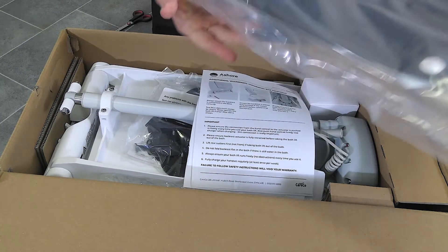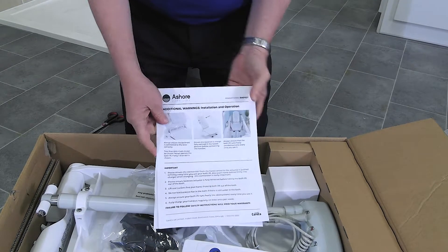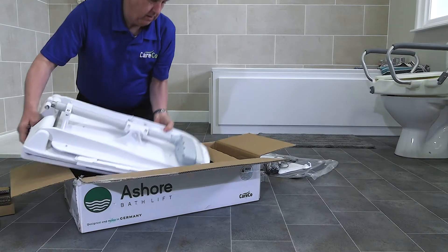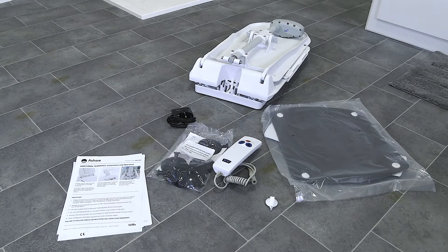Once opened, you should find printed instructions packaged with your Bath Lift. Please keep hold of these as they contain useful information on the assembly and best use of your Bath Lift. Lift out the various components and set them to one side. You are now ready to begin assembly.